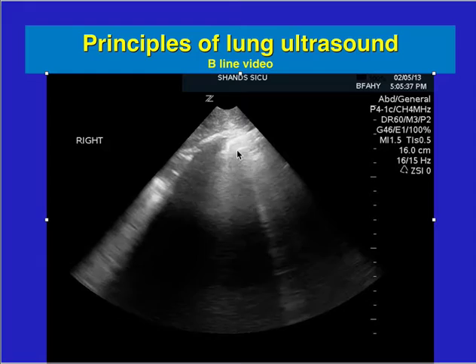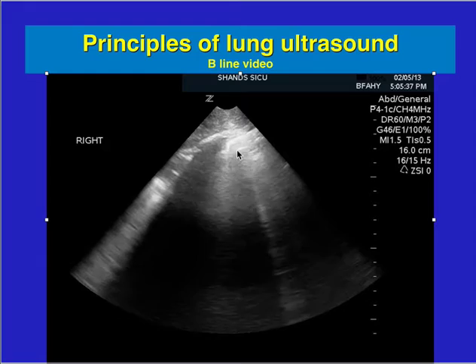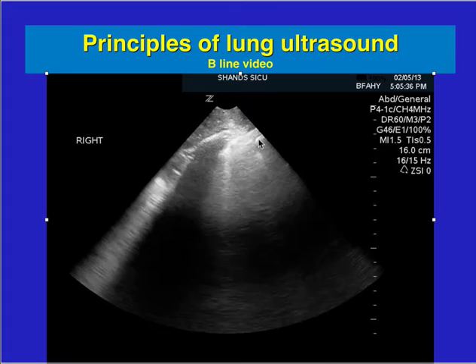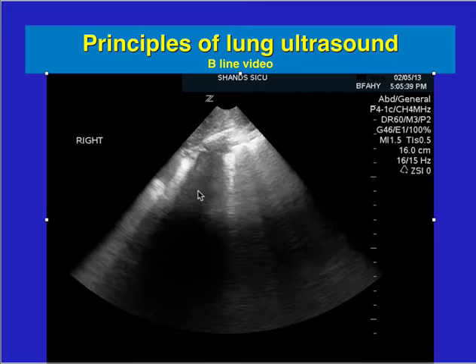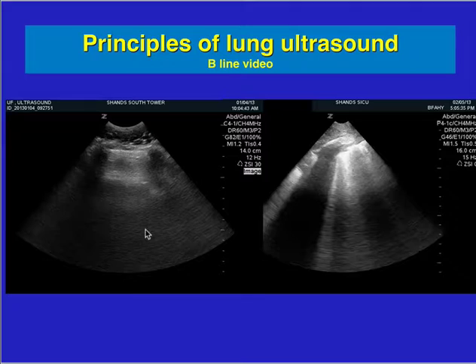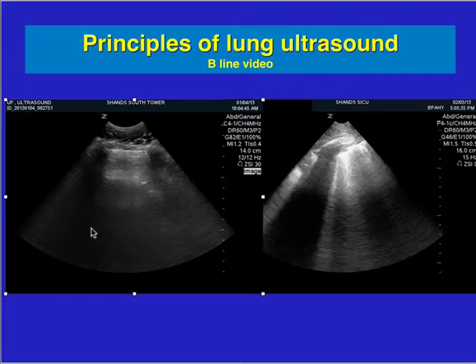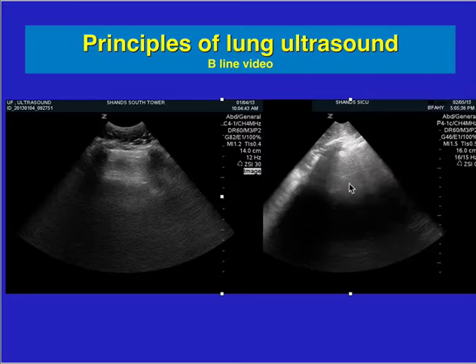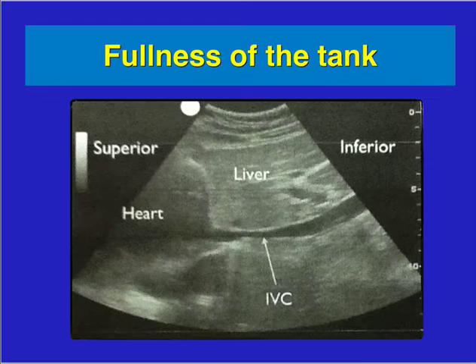Here is a clip of a patient with B lines. As the chest wall moves, you can see the lung is sliding. If you can't see this clearly at this depth, zoom in on the pleura and reduce the gain to see sliding much better. Here is a comparison of A lines and B lines: A lines are horizontal, B lines are vertical. If you see A lines bilaterally in a cardiogenic or hypoxic patient, you would probably be okay to give more fluid.